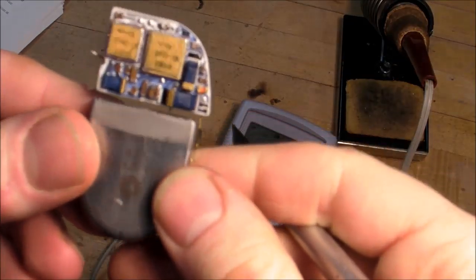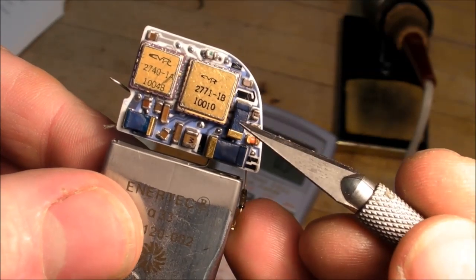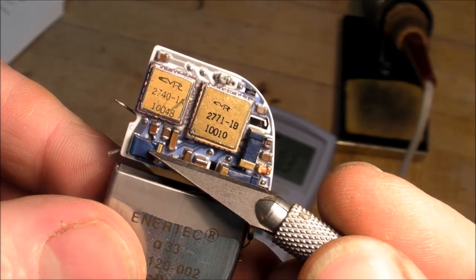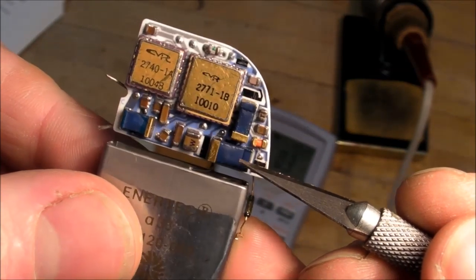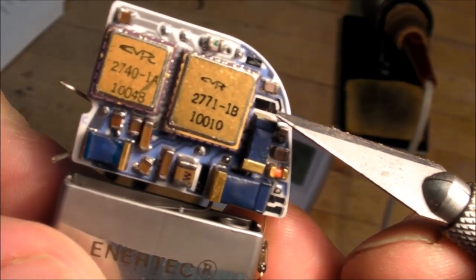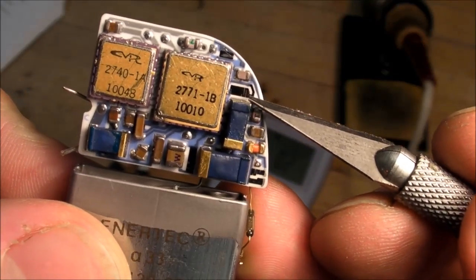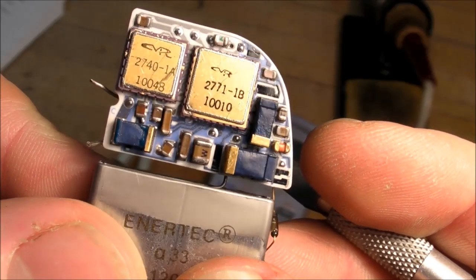Just a few other things here. I measured these blue things on the LCR meter. Their capacitance is 10 microfarad, 70 microfarad, and 100 microfarad. And also, maybe you can just about see the trace, those black carbon composite traces on the board, and you can see how they're laser etched.